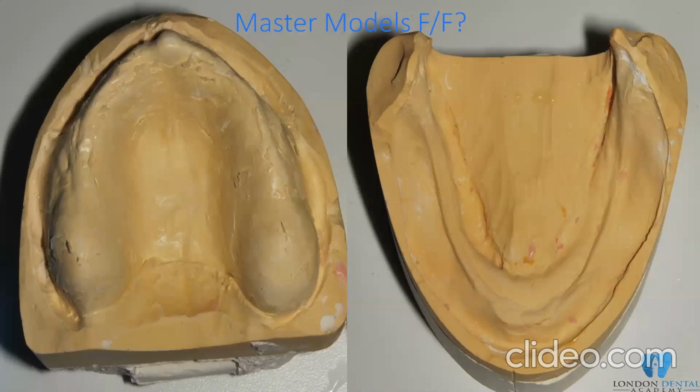Now the trick, and here I don't want to go into further details on this subject. When you do your dentures, I will ask my technician to make the base plates in clear heat-cured acrylic. At this stage of taking the bite, I will get stable base plates. I can take the bite clearly, and I'll have early information about the stability of the denture. So I don't want to leave it late in the process to get the information I want about my stability and retention. And if I need to do any changes at any stage, I can do that straight away.